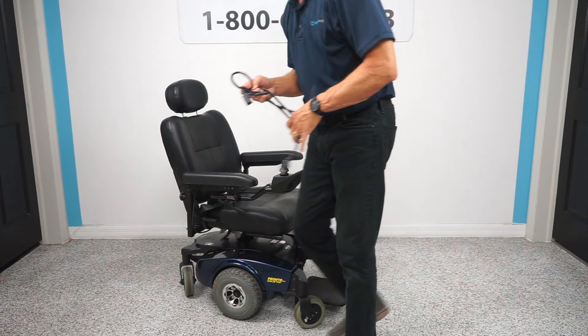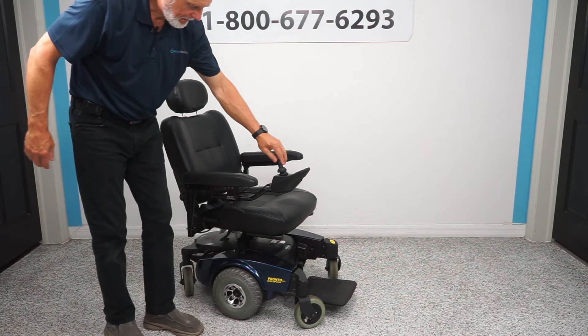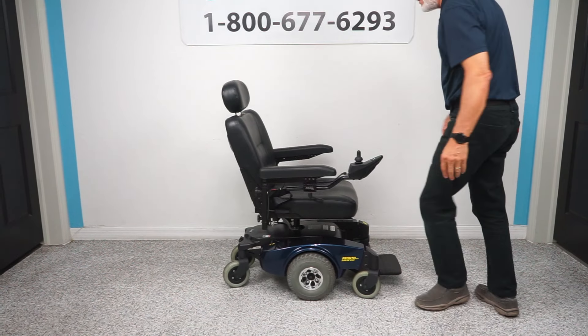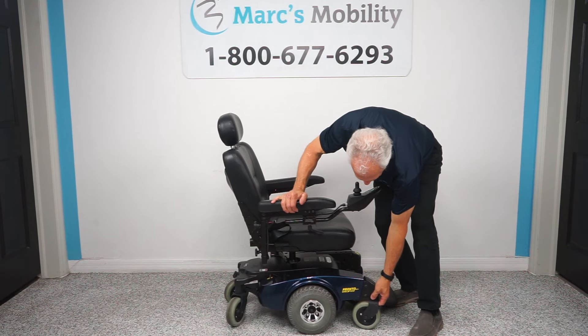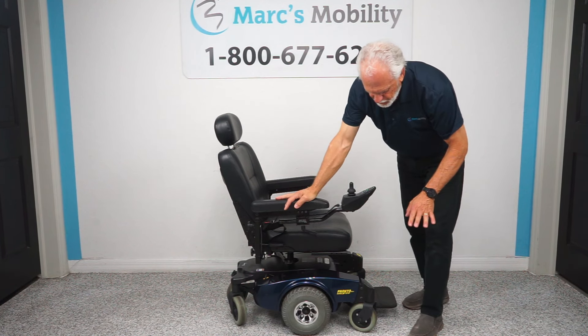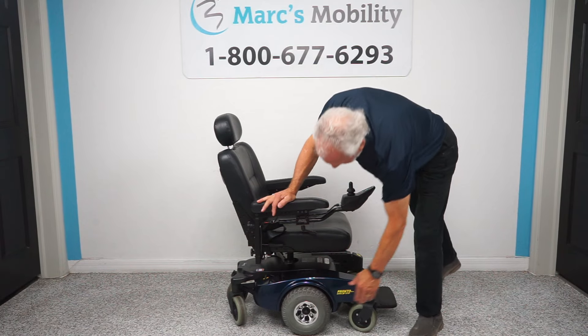Another thing that makes this chair very special is the suspension. This chair has great suspension. When you go outside in the yard, the front end — see that suspension? It's really well calibrated. If you go in the grass, it's going to drive through well. These are solid tires.